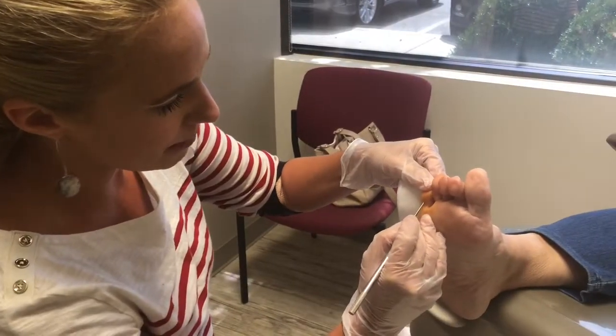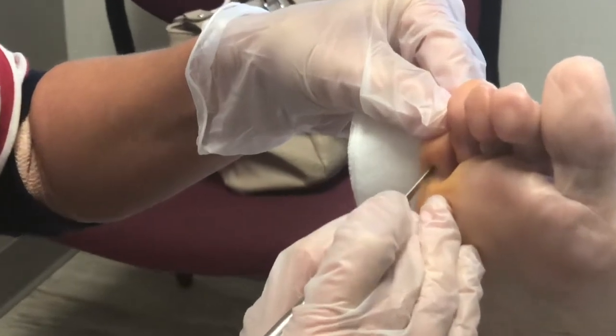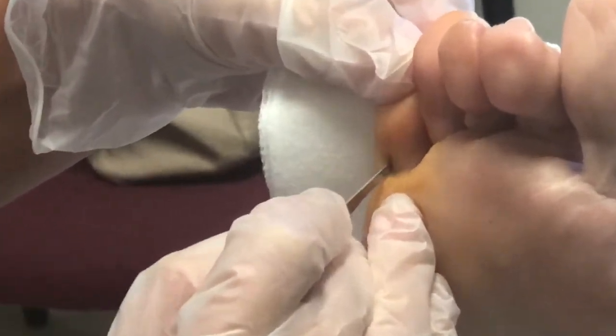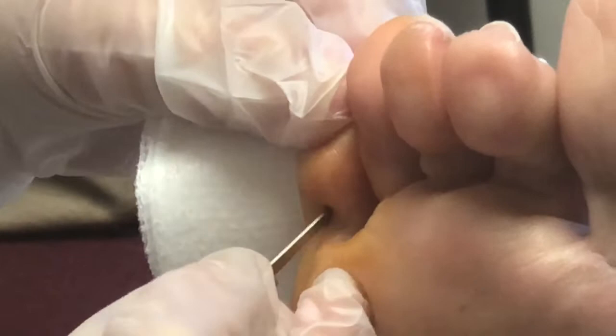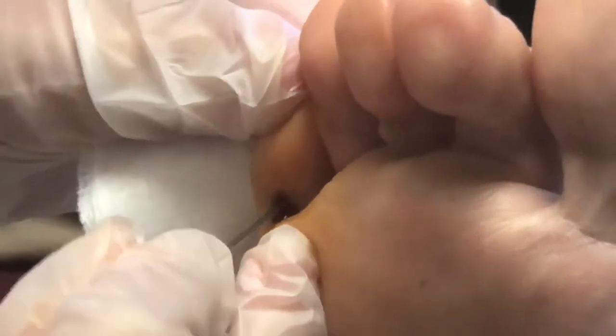Here we go. We're going to make a small little stab incision on the bottom, just enough to get in there to the tendon to find it. I can feel it right there. There we go. Hear that little crunch? You can hear that.